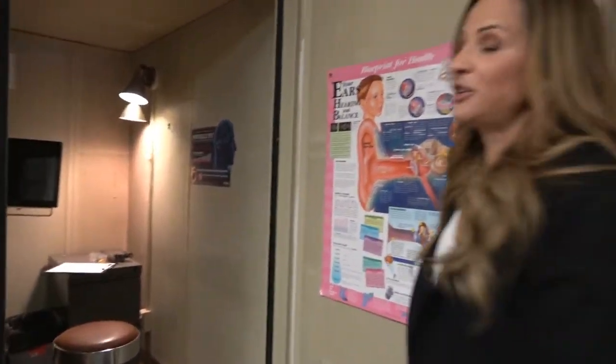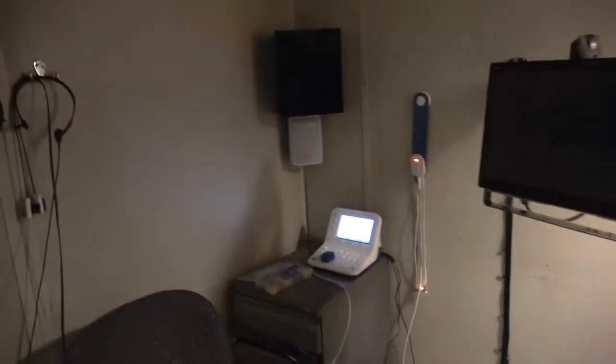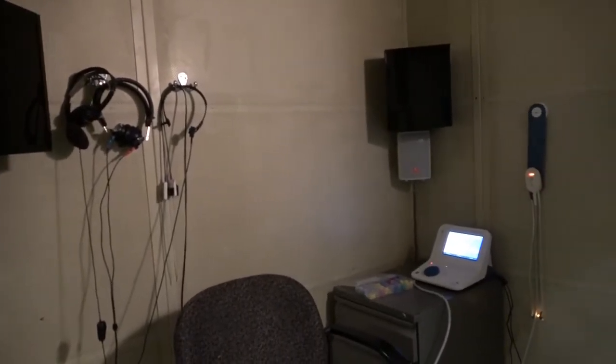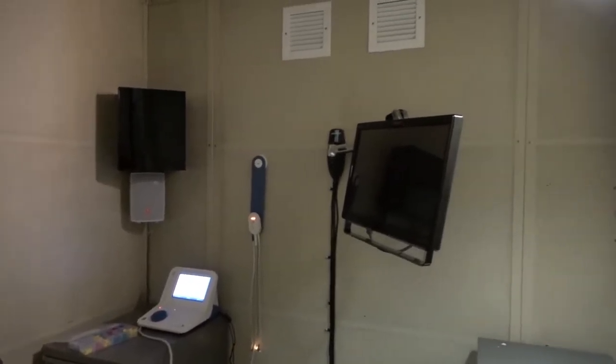So when you come inside, you're going to, of course, watch your step because there is a big step up. And as you can see inside here, there's a couple of different machines as well as wires and a nice comfy chair for you to sit down on. And yes, although this looks like an interrogation room, we try to make this as pleasant as possible. So the patient will come in, have a seat right here in the chair with the arms, and we'll ask you a couple of questions first.